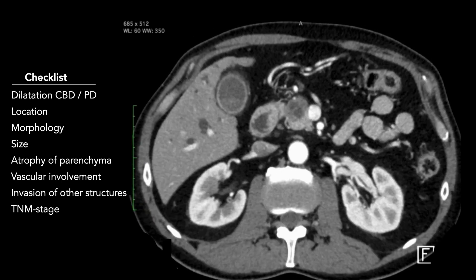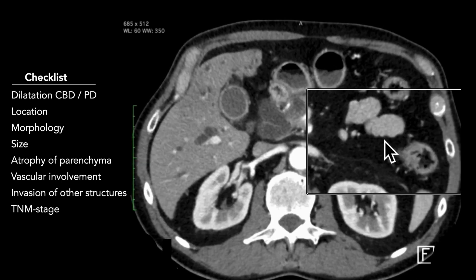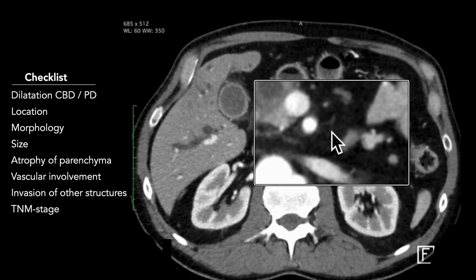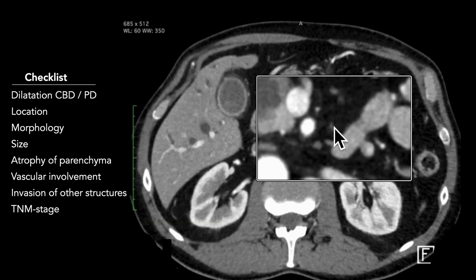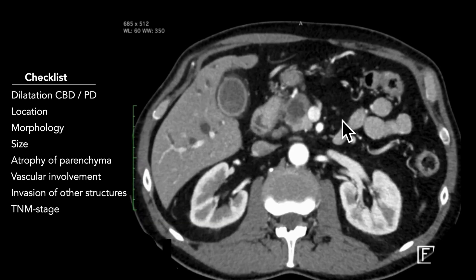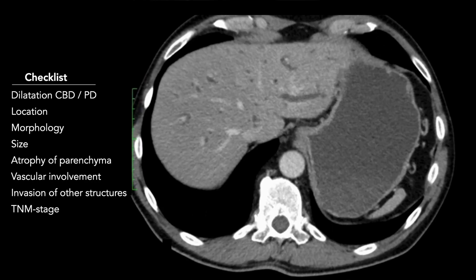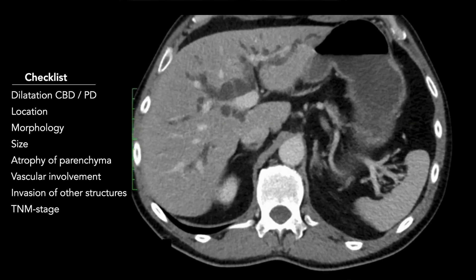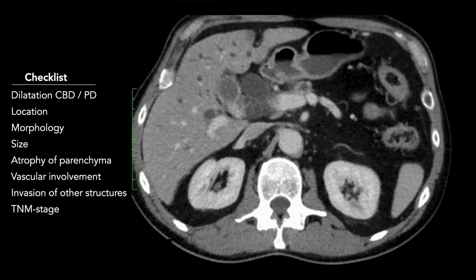Some lymph nodes are seen, but all are small — less than 10 millimeters in short axis — so no clear signs of lymph node metastasis. The portal venous phase shows no signs of liver metastasis.